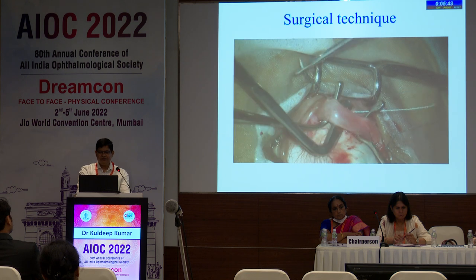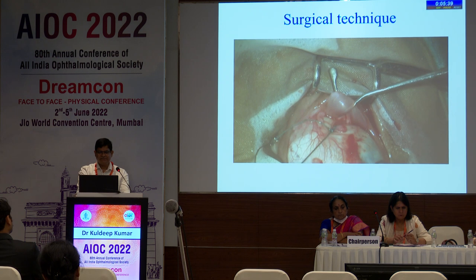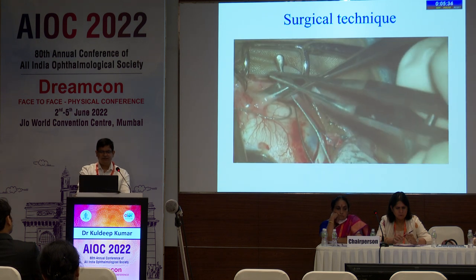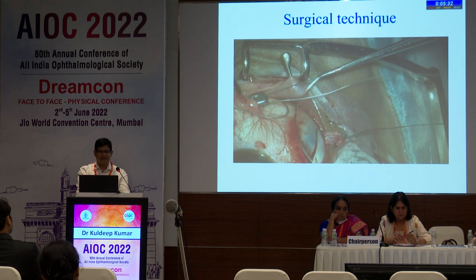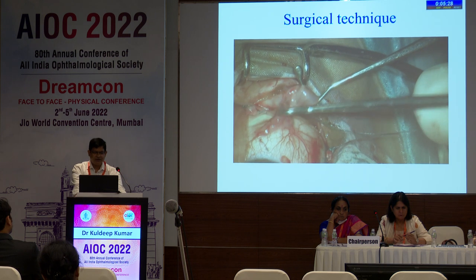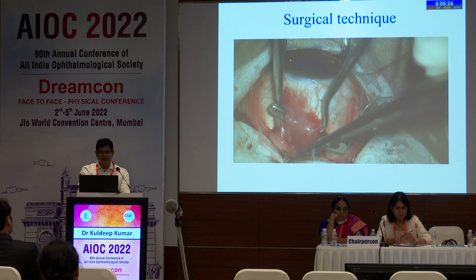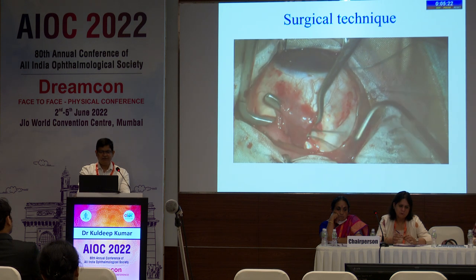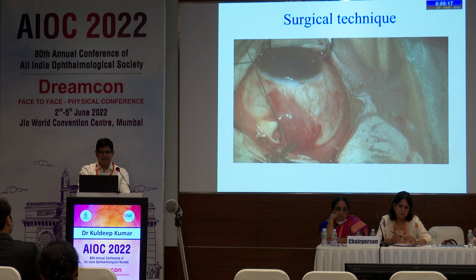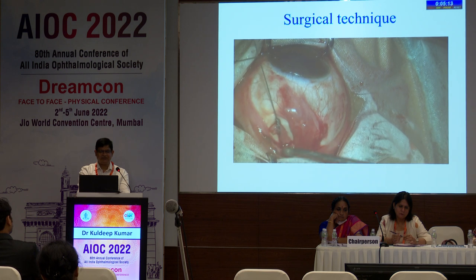Now this inferior one is being passed under the inferior oblique muscle. And this is being passed under the inferior rectus muscle. Now you can see the inferior half has come to the medial side of the inferior rectus muscle. This superior half is being passed under the superior oblique and superior rectus. Now this muscle has come medial to the superior rectus.